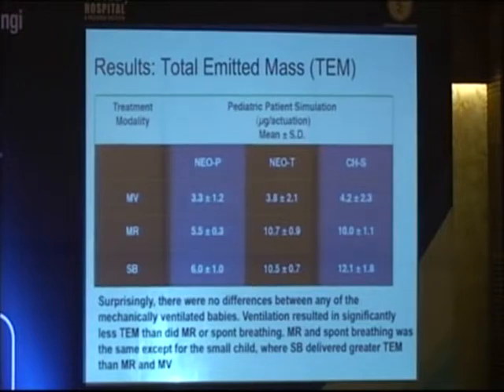I'm not telling you to remove your patients from the ventilator, but I'm not saying that I never have either. But in spontaneous breathing, clearly the amount of drug that was delivered to the filter in the lung model was similar to during manual resuscitation because we don't have a humidifier. So humidity is not so much your friend but your foe when you're delivering inhaled bronchodilators.